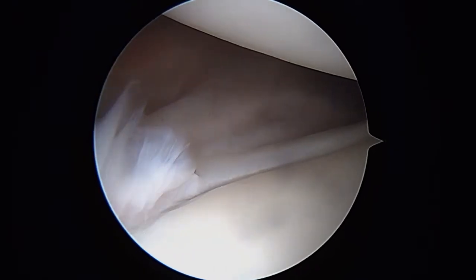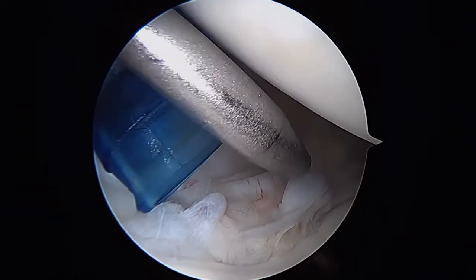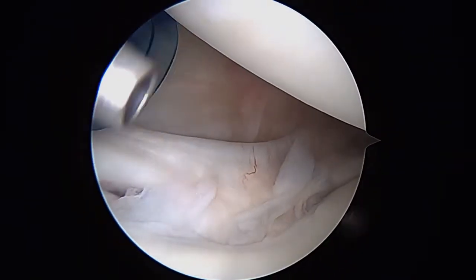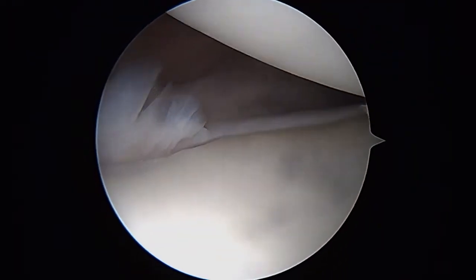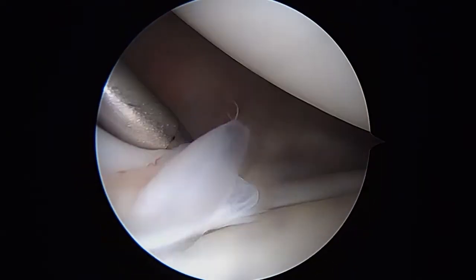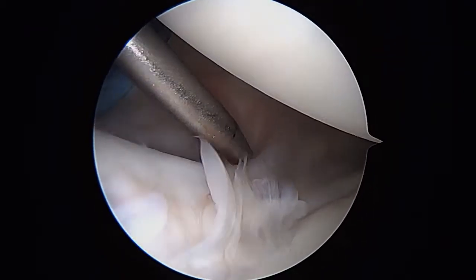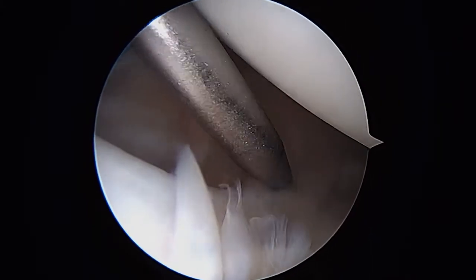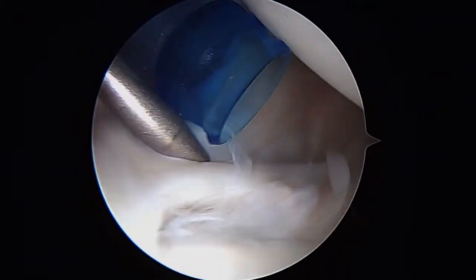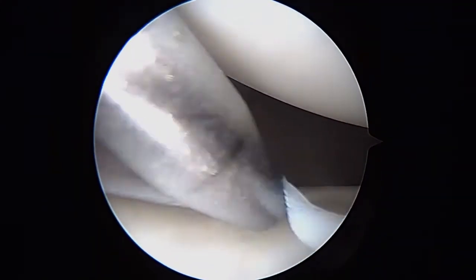As we look down the front, what you see here is the labrum — it's just very deficient in terms of serving as an attachment site for the glenohumeral ligaments. Here's the labrum on the edge; it's not very large. And here's one of the anterior glenohumeral ligaments. We're going to tighten up this entire area. As we push down around, we can get all the way through the back of the shoulder, and that's a sign of instability as well.